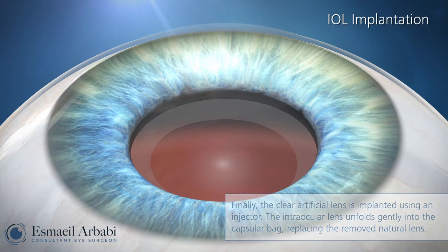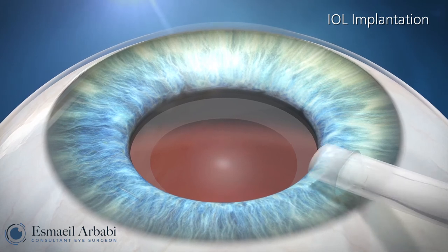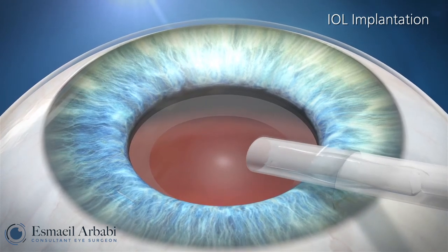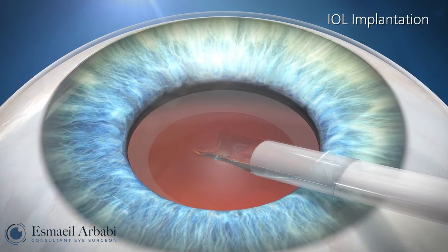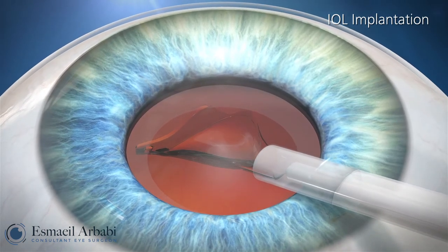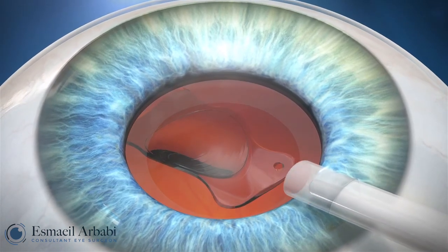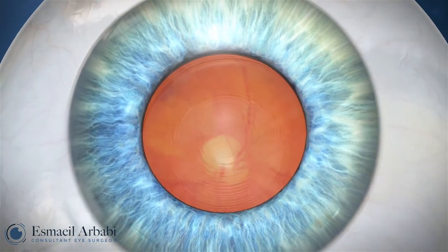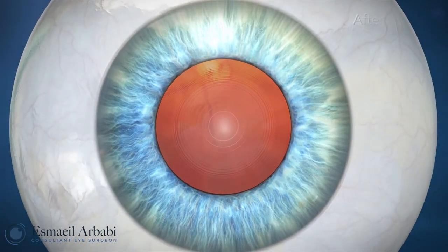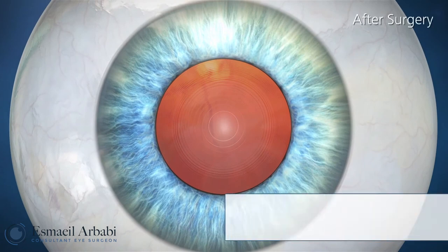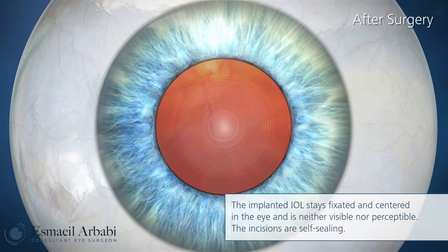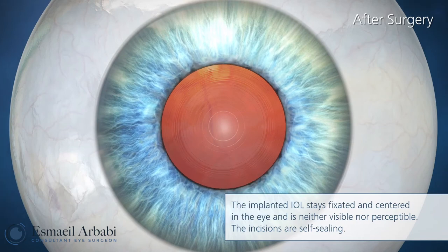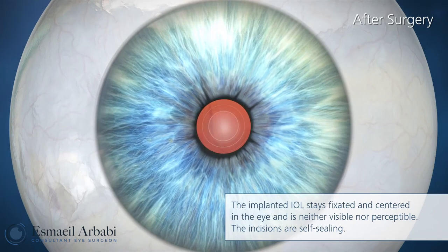The intraocular lens unfolds gently into the capsular bag, replacing the removed natural lens. The implanted intraocular lens stays fixated and centered in the eye and is neither visible nor perceptible. The incisions are self-sealing.